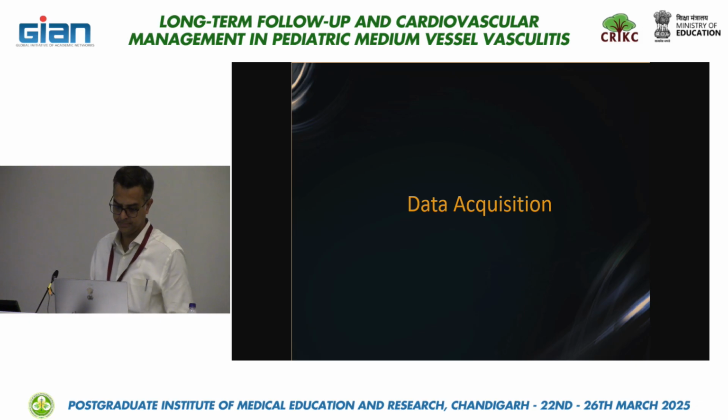Once the child is in, depending on the age of the child, the scan requires sedation or is done without sedation. We train the parents, we train the patients, and that's how we get good images. To cover these aspects and how we do it, I request Dr. Arun to go forward and let us know what our protocol is and how we do it. Thank you, sir. Thank you, Dr. Shrestri, for covering the initial part.